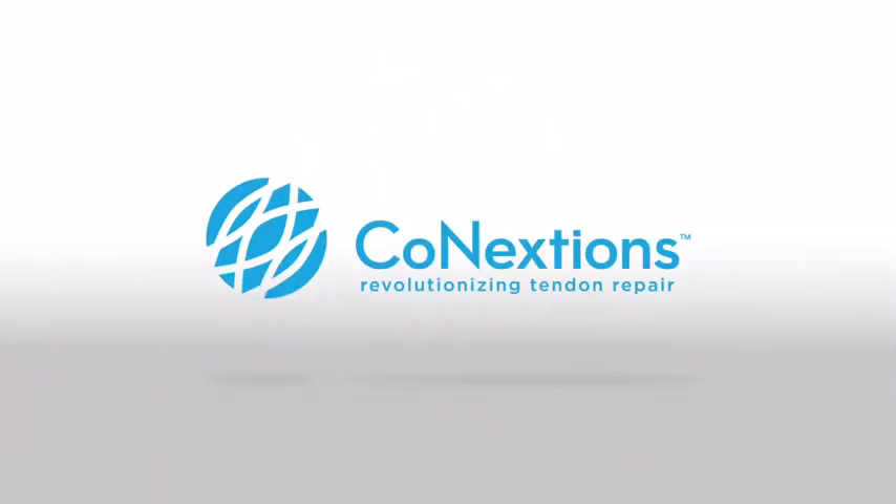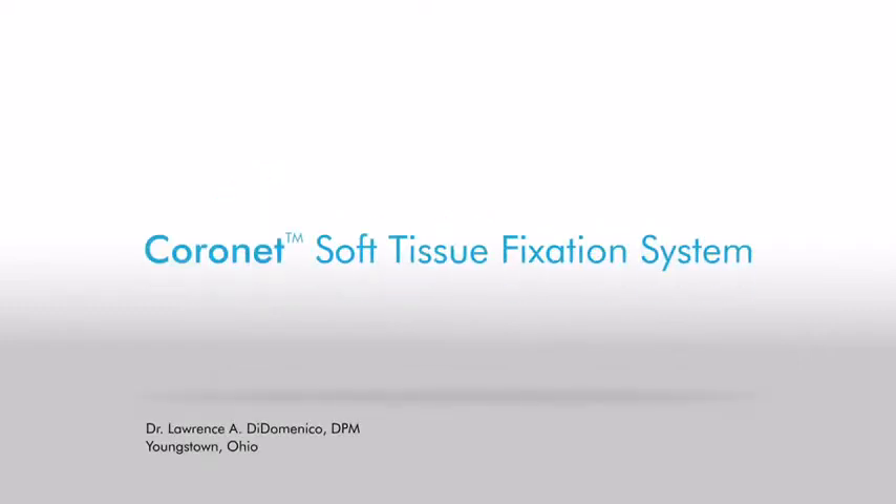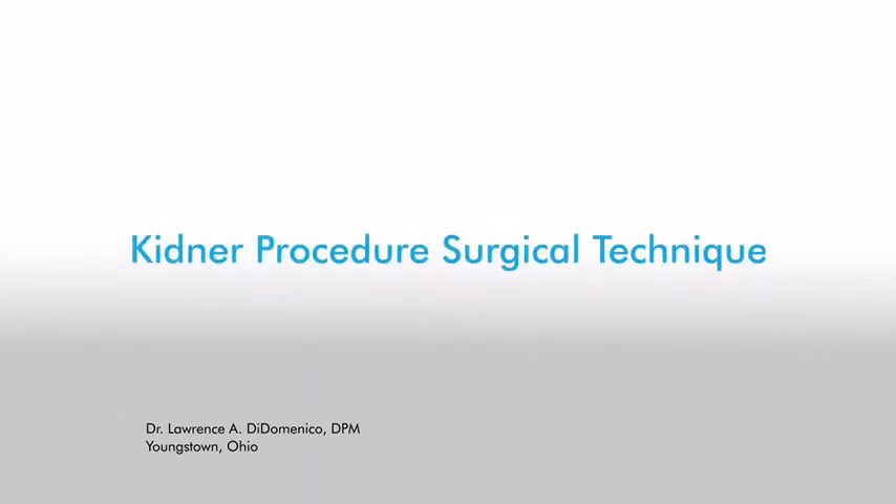CoNextions Medical is a medical device company dedicated to dramatically improving patient outcomes and the economics of tendon repair. This animation demonstrates how Dr. Larry DiDomenico uses the Coronet Soft Tissue Fixation System from CoNextions Medical during a Kidner procedure.